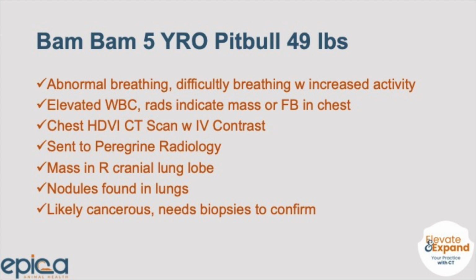He is a 5-year-old pit bull. He weighs 49 pounds. He breathes abnormally and has difficulty breathing, specifically when his activity is increased. At the veterinarian's office, he has elevated white blood cells, and the radiographs they took indicate that there's a mass in the chest, or could be a foreign body.